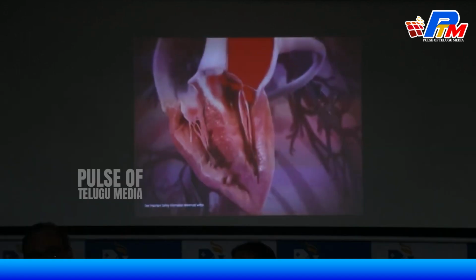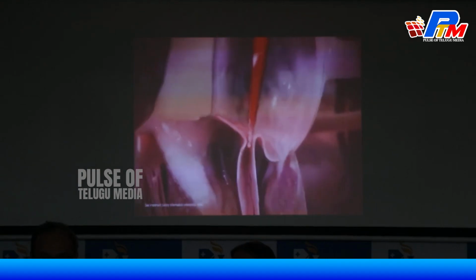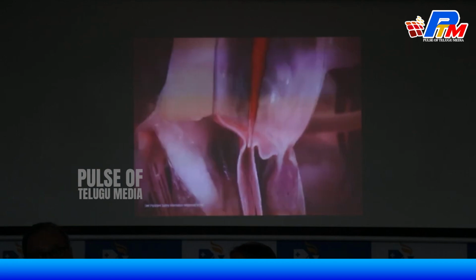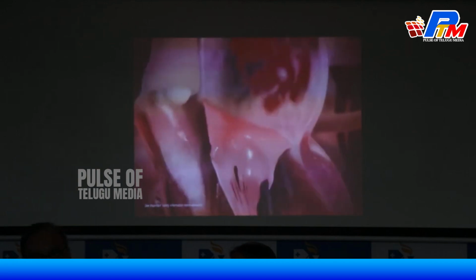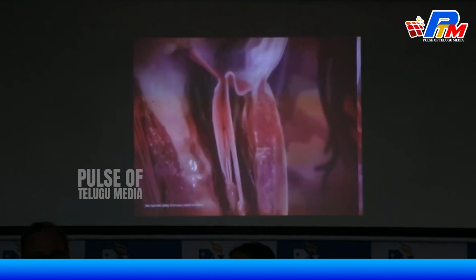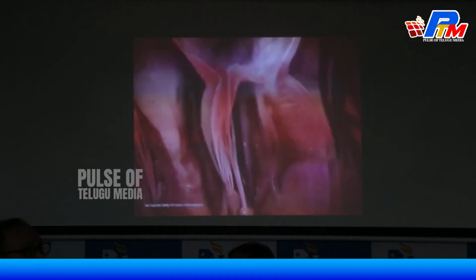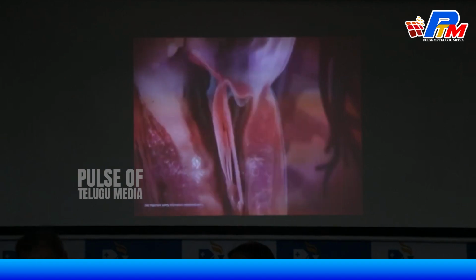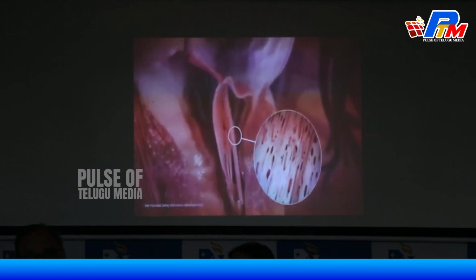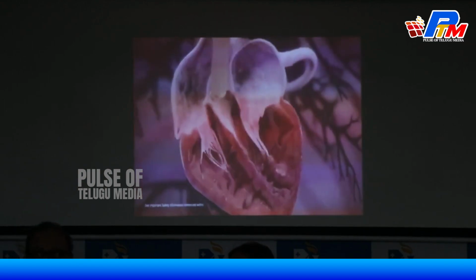We go through a catheter towards the right heart, do a septal puncture and go towards the left, and we take this mitral clip, which is a metal clip with polyester fabric material. We take it through the right femoral vein towards the left side, and we do it fluoroscopy guided and with transesophageal echo in the cath lab. It's a little bit like a hybrid procedure, and we do it under fluoroscopy continuously with transesophageal echo with 3D view, where we can see the mitral valve in 3D, and we can see the clip, the positioning of the clip, and where exactly the leakage is coming.